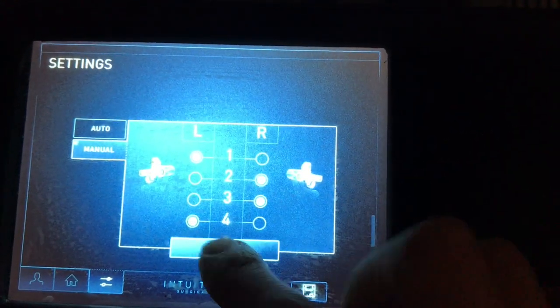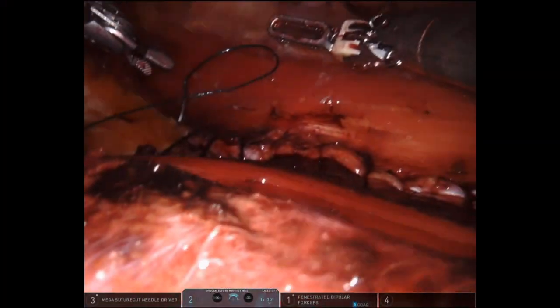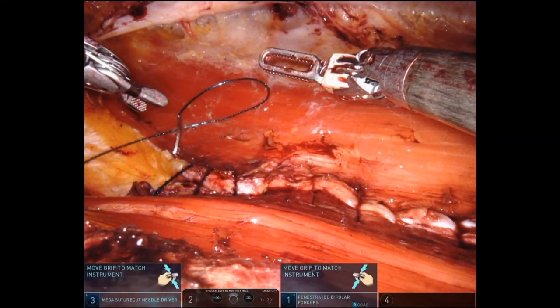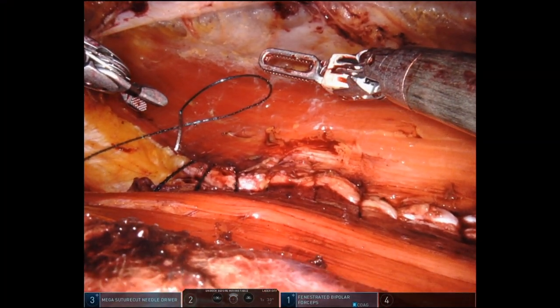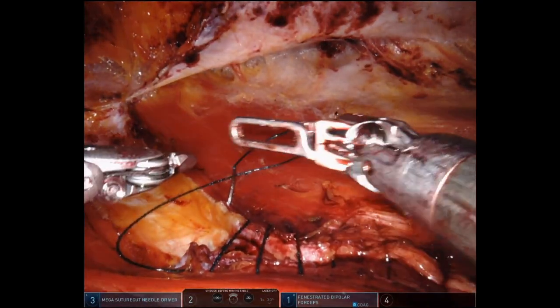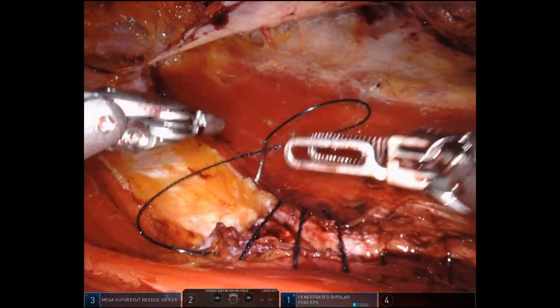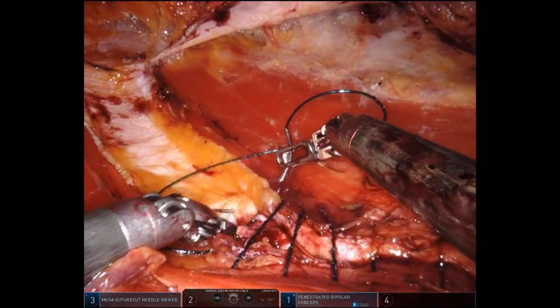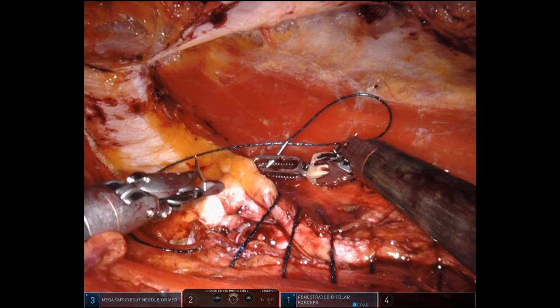This video of the touchpad is not from this case, so I actually had to reassign arms 1 and 3, not 2 and 4. You can see at the bottom of the screen that 3 and 1 are not in the usual order of 1, 2, 3, 4 — because the instruments are reassigned.